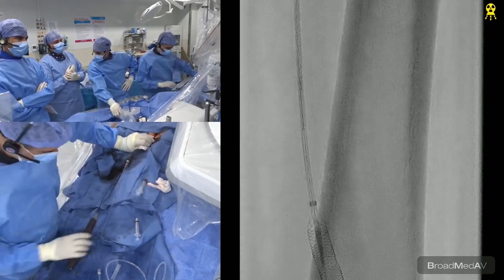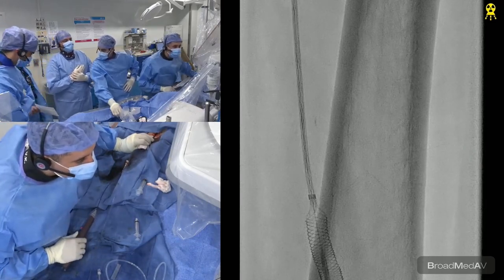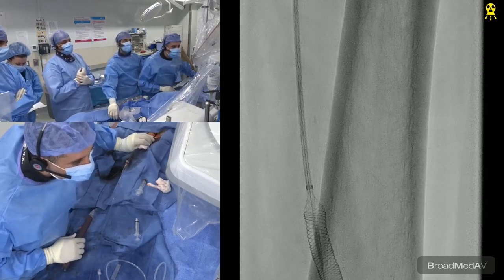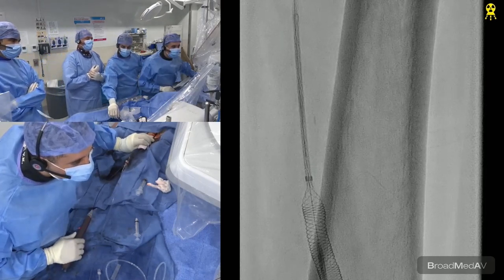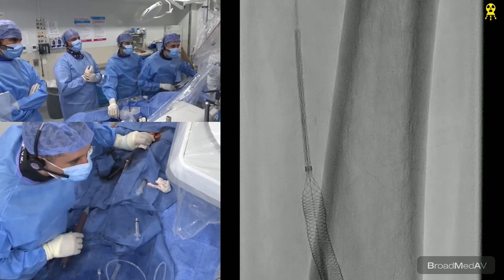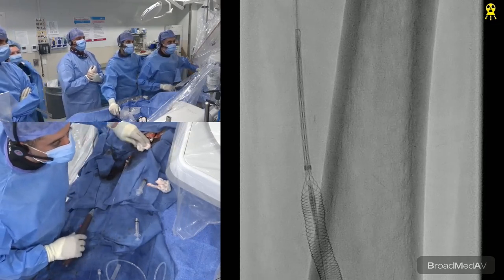The beauty of what Aramin and I talked about is something we firmly believe. Both of us published a paper just recently looking at our data of 600 patients who had a DCB used as vessel prep for Supera, and that actually reduced the TLR rates when you elongated the Supera. So it kind of goes logical.